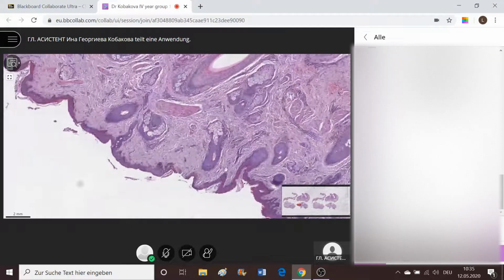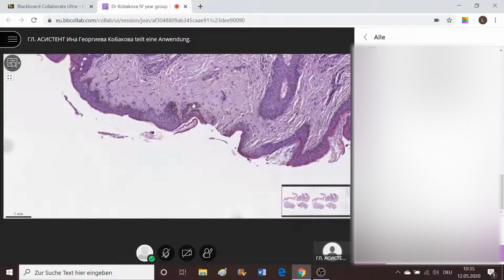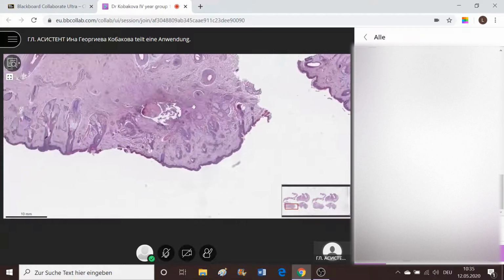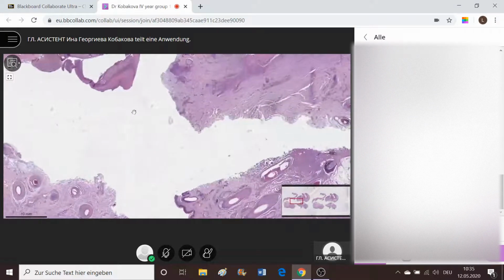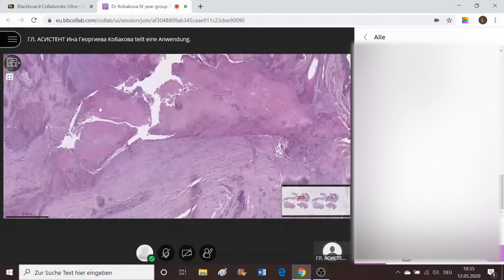On the dermoepidermal layers, there is a basal layer of cells where there are lots of melanocytic structures, as you can observe them here. Pretty much normal structures will be also the object of asking from the professor, so you should have this in mind. The field of caseous necrosis itself suggests that here there is skin tuberculosis.